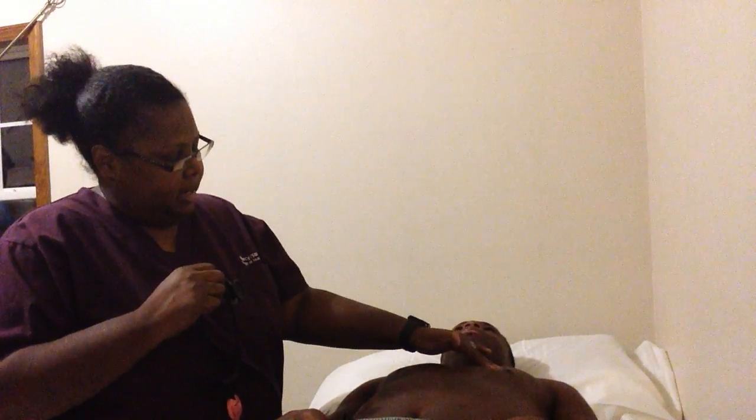Okay. I'm about to listen to heart sounds. I'm going to listen to heart sounds on each valve, starting with the aortic. Then I'll go over to the pulmonic. I'll come down to the tricuspid, which is fifth intercostal space, then midclavicular. I'll go over and I will listen to the mitral for the apical pulse.